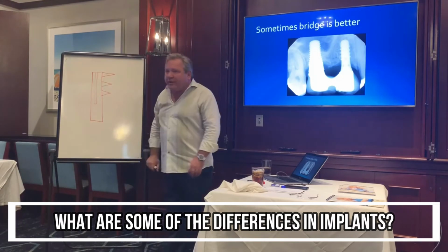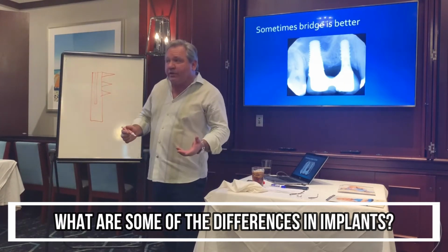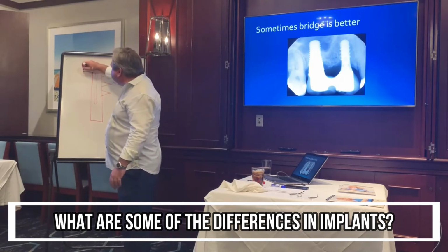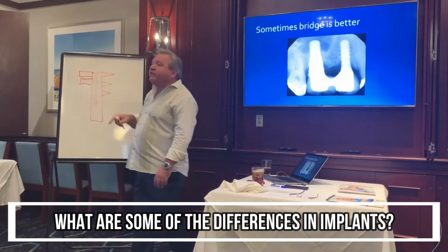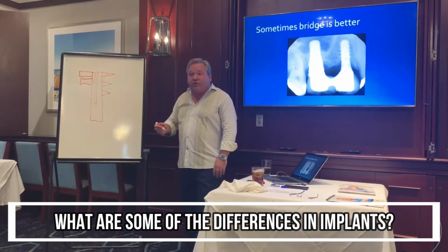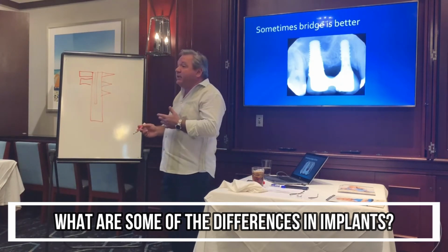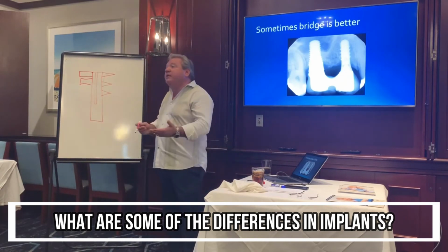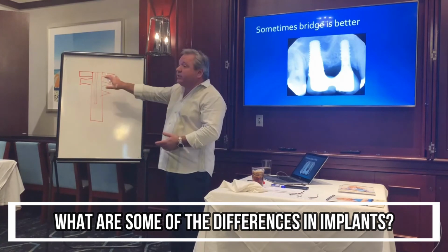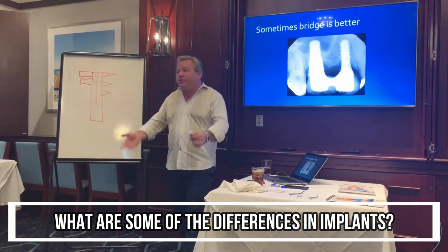But if you take a normal thread like this, you get a certain amount of surface area. If you change your thread design, do a square or buttress or a couple of the other thread designs that are out there, you can gain a lot of surface area. You can gain up to 60% more surface area simply by changing the thread design on your implant. So what we use in one area may not be the same as in another area. So not only is there a difference in the strength of the implants, but there's a difference in thread designs as well.